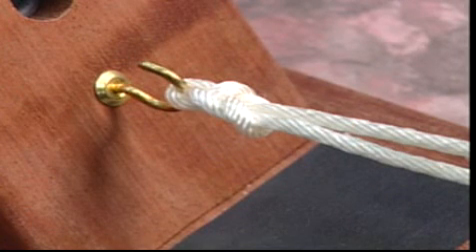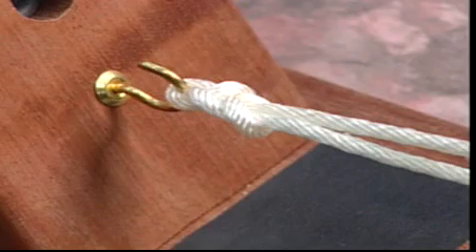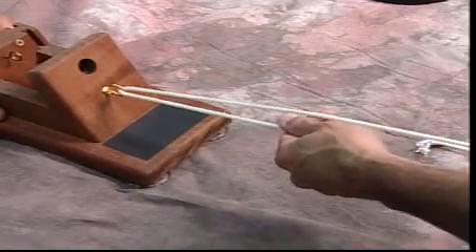The Westin knot is a self-locking knot. Here the left limb is our post limb and the right limb is our loop limb.